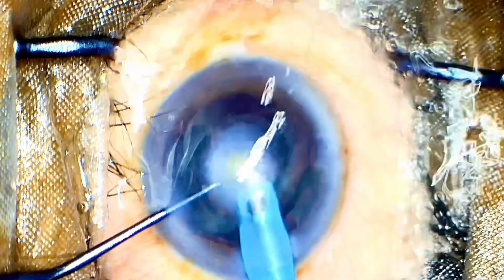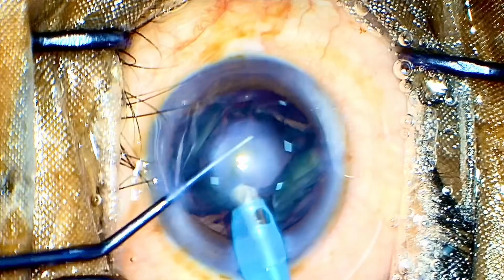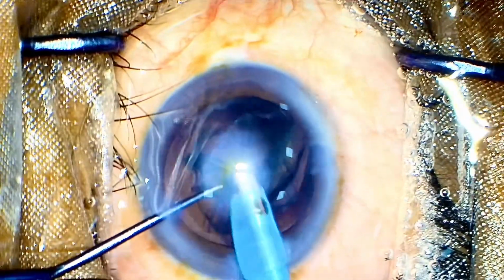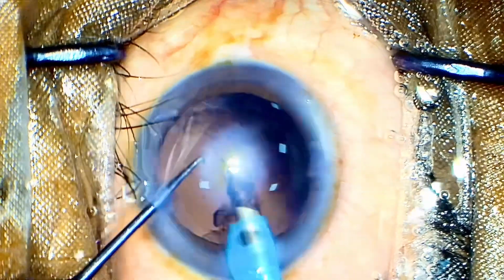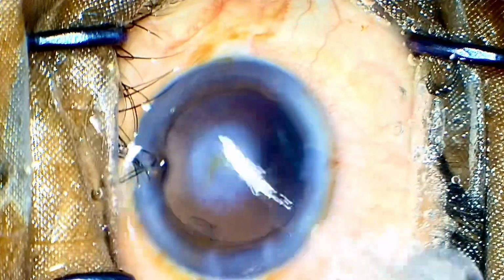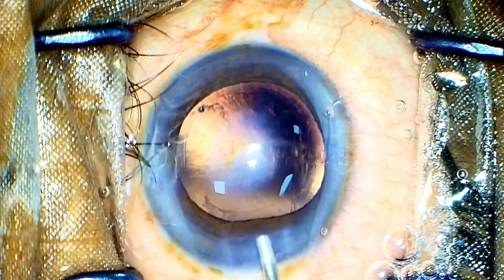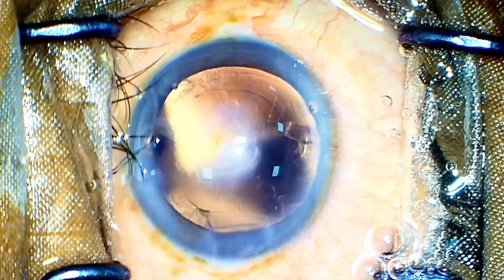So yes, just like that, we are down to 70% of the nucleus, with only 30% of the epinuclear shell and the cortex left. Surprisingly, there is not a lot of cortex and I won't need to clean it up much with my irrigation aspiration. And here we go, the case is about to finish, and the last bit has come up. The anterior chamber has held well, and as you can see, this beautiful brilliant glow, just like that, -8 diopters of myopia has gone, and we'll be implanting him a monofocal lens.